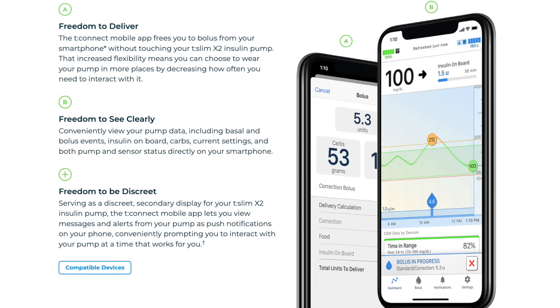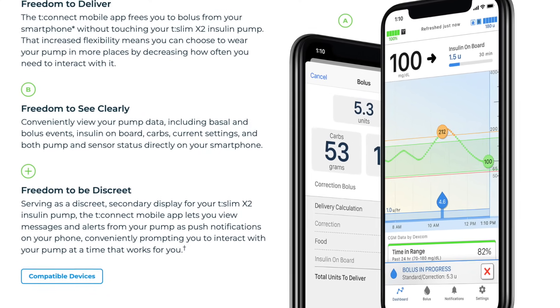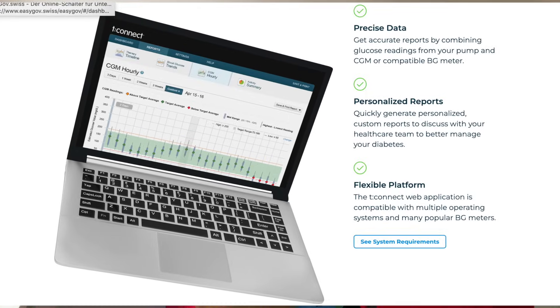In many countries the pump also comes with the T-Connect app, but this app is mainly good for viewing data from your pump on your phone. You can't really control the pump from the phone — except in the US where you can bolus from your phone using the T-Connect app. You can also use T-Connect on your computer to wirelessly download pump data and share it with your medical professional.